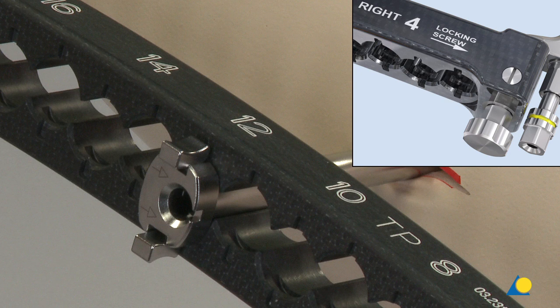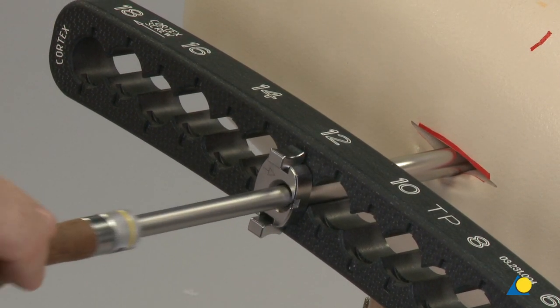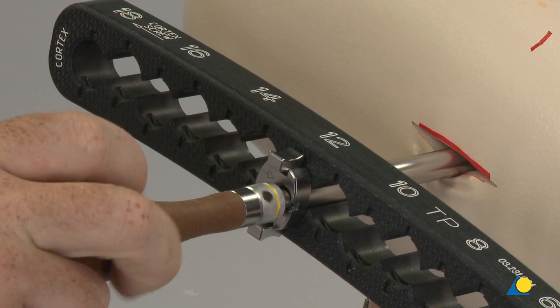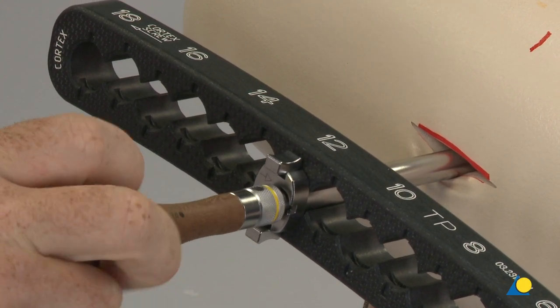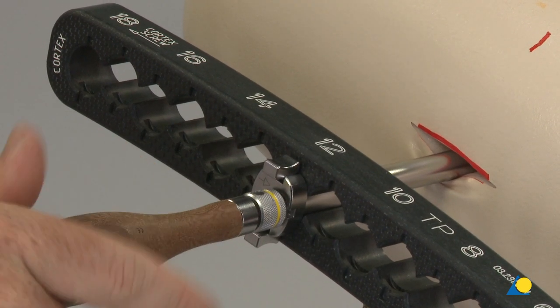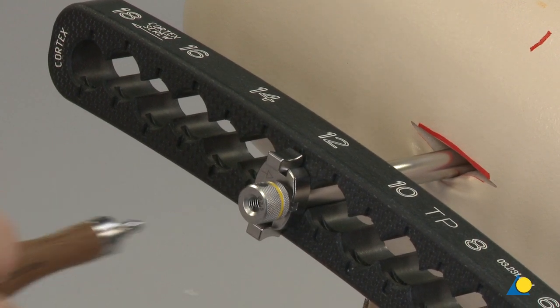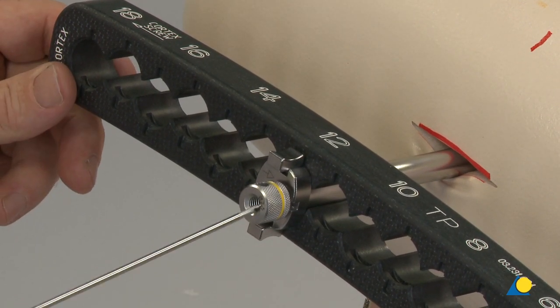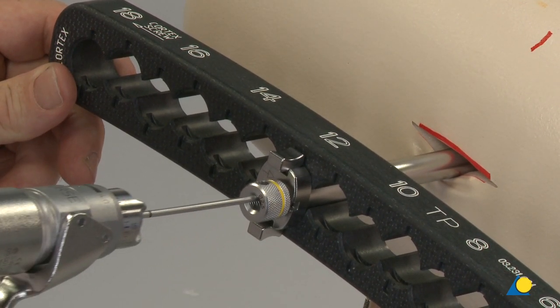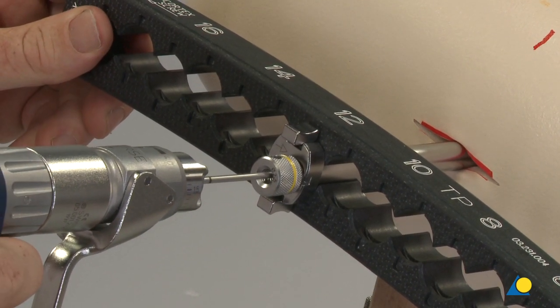Ensure the arrow on the guide sleeve is in the direction of the locking screw arrow on the aiming arm. Insert the wire guide with the handle through the guide sleeve and thread it into the plate hole. Remove the handle. Insert a 2.5 mm guide wire through the wire guide and into the bone using a power tool.